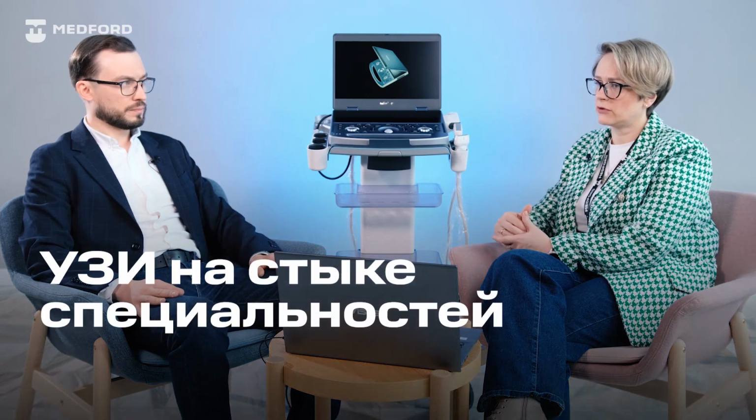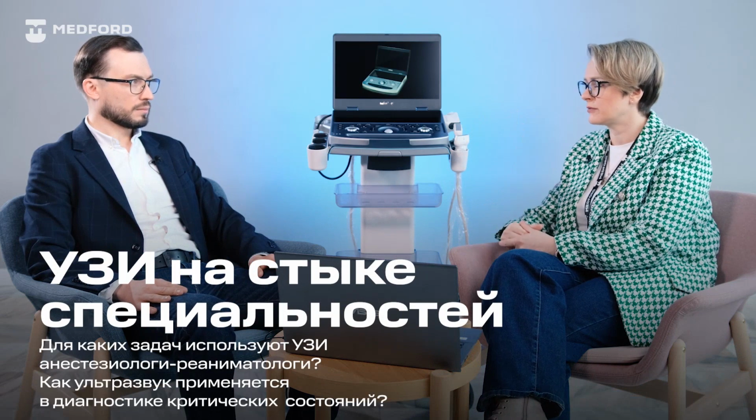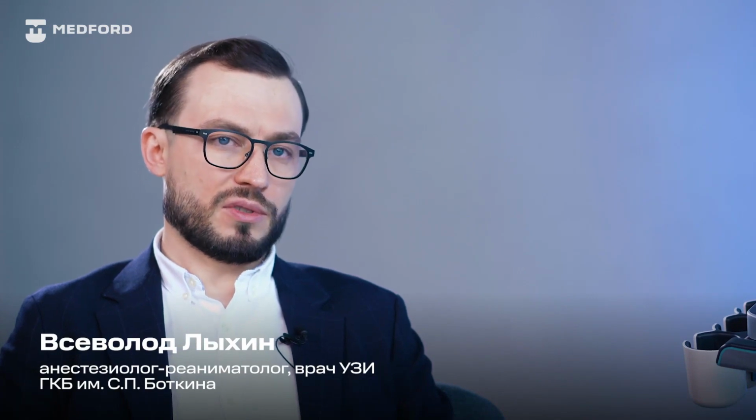In addition to regional anesthesia and vascular access, what else is an ultrasound device in the operating room for an anesthesiologist-resuscitator? Yes, well, if we look towards diagnostics, then here we are interested in the so-called urgent protocols, which allow us, in a focal manner, in a focus group of patients, to assess a life-threatening condition. These are the conditions that, if we do not take some action now, may lead to the death of the patient or severe disability in the future.